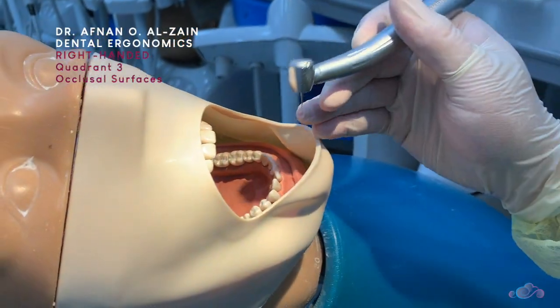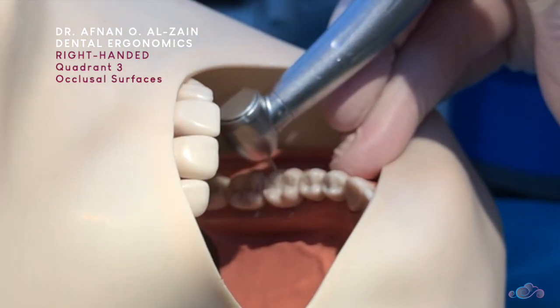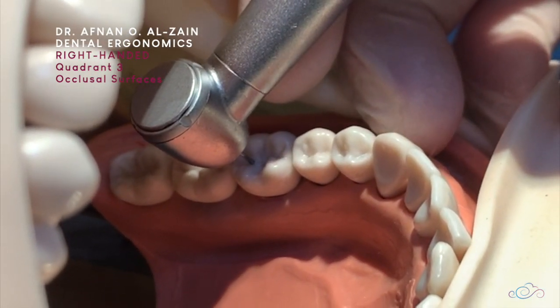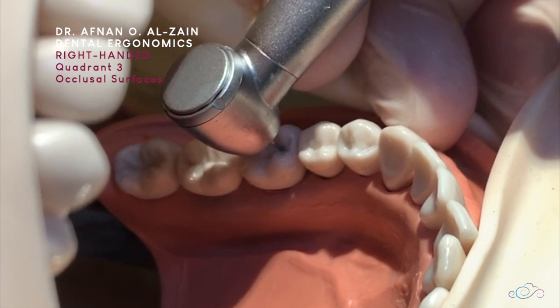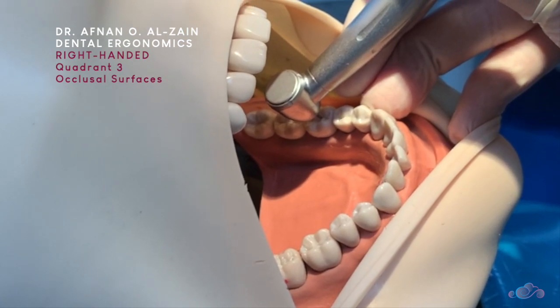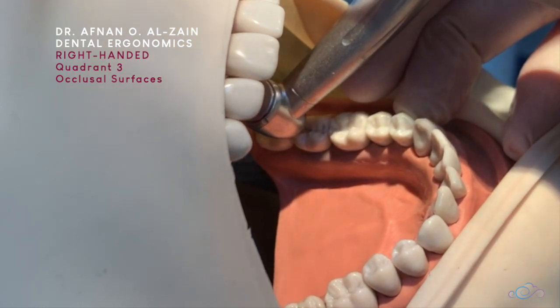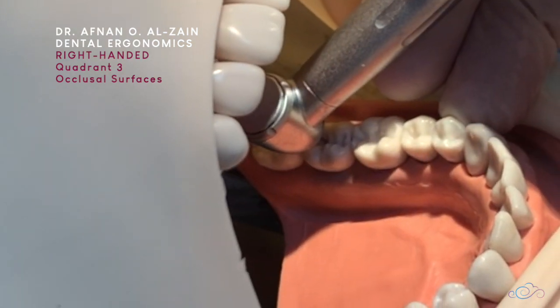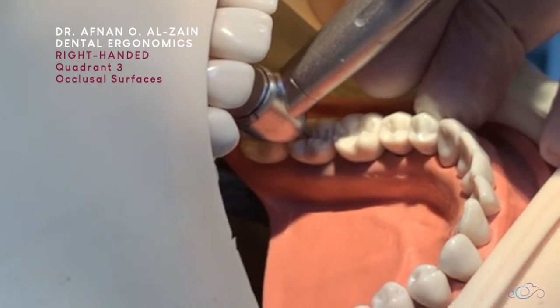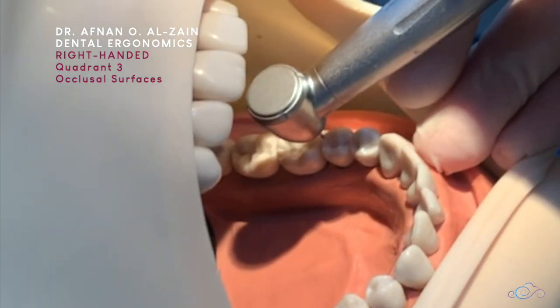When working on quadrant three, you're going to make sure you have finger support on any hard tissue — either the tooth or alveolar bone. When you're working, you have to make sure that you can see the tip of the burr in the grooves, so you cannot work blindly. When you want to work on the second molar, you're just going to extend your fingers to the posterior a little bit, making sure you have proper finger support.